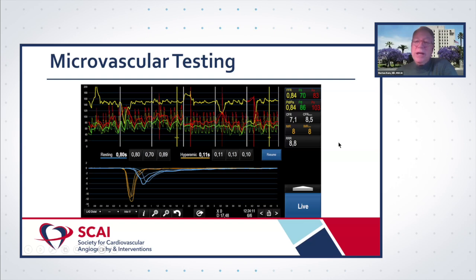Well, so I think the concept of microvascular disease divided into its 3 different phenotypes is important. So you've sorted out this chest pain with non-obstructive arteries, and not a single non-obstructive artery, in this case the LAD, is responsible. It's not a function of his lesions or his CFR, so it is a function of his physiologic narrowing in response to acetylcholine that you showed us. And it'll be interesting to see in his clinical world, as you've done, whether those changes correspond to any other objective evidence of ischemia, or is it just a symptomatic finding?